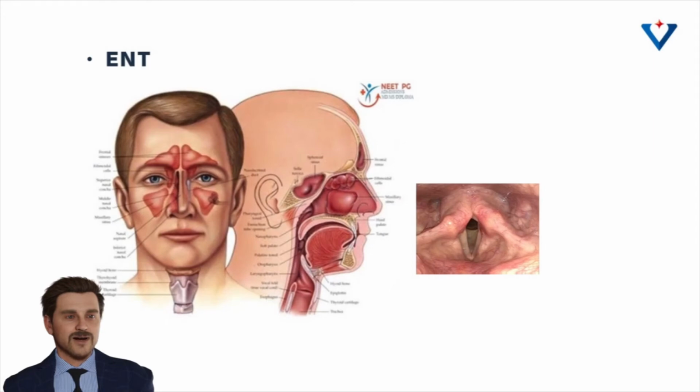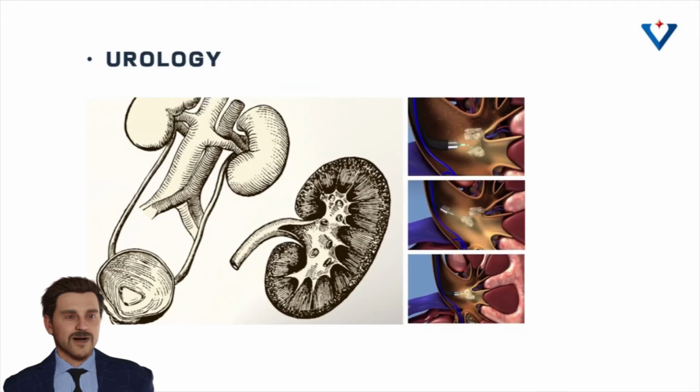Rhinolaryngoscopes use fiber optic or video technology to examine, diagnose and evaluate the normal physiologic and pathologic conditions of, among other organs, the larynx. Only for ENT. A flexible ureteroscope is for treatment of ureteric or kidney stones. Flexible cystoscopy is a procedure, performed under local anesthetic, that allows your doctor to look at the interior lining of the bladder and the urethra, the tube draining the urine to the outside, using a thin flexible tube with a tiny camera attached.